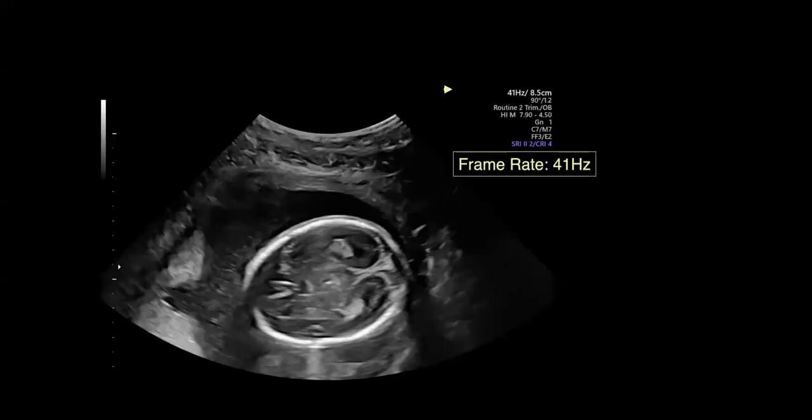So once we've decreased that depth and adjustment, notice now that our frame rate has improved and now has increased to 41 Hertz. Now, what else can we do to improve our temporal resolution?